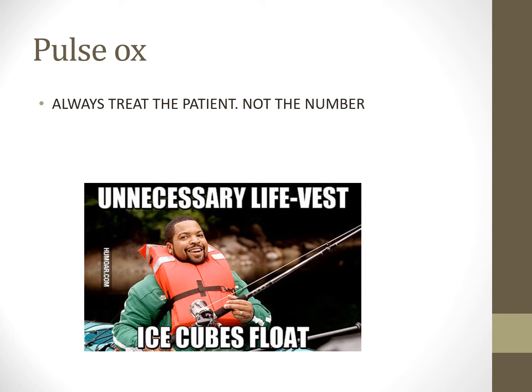There was an MRI situation where we were taking a patient to MRI, and we're in the MRI, and the only thing that's accurate in the MRI was the end-tidal CO2. Everything else gets thrown off by the giant, powerful magnet thing. Even their EKG gets thrown off. So the only way you know that patient still has a pulse and a heart rate and is breathing is because end-tidal CO2 is uninterrupted. So that is the only accurate thing during an MRI currently until they figure out some other way to get accurate monitoring during those procedures. Even the special MRI EKG electrodes were not great.